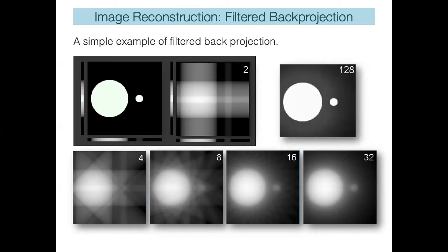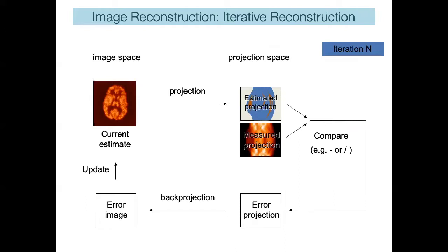Like I said, this is typically not done on newer scanners anymore. On newer scanners, we really do reconstruction through an iterative reconstruction process using expectation maximization algorithms.